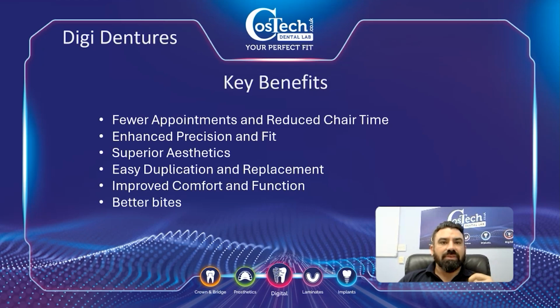When we have the dentures, we all know alginate can warp, pouring up, there's an error there. There are so many points of failure. This negates everything.